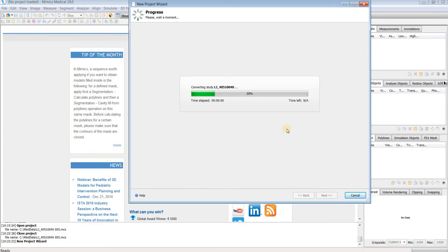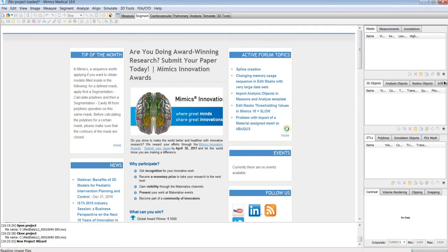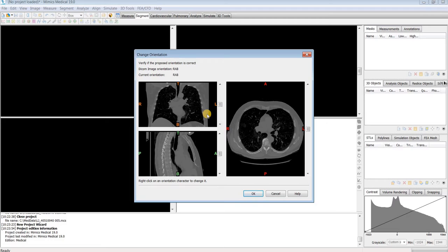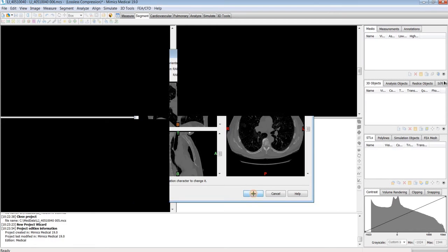This is going to convert it into a Mimix project file, or .mcs, which is going to contain all of your images as well as any work that you do to those images. Here it's asking me to confirm the orientation of my images, and since it pulled this information from my DICOM headers it all looks OK, so I'm going to just hit OK.